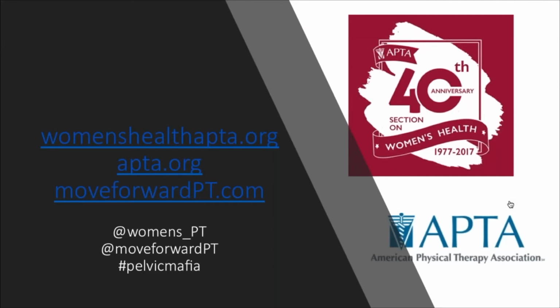So in summary, real-time ultrasound can be used to give additional information to clinicians regarding muscle activity related to the bladder, and can be very beneficial as a form of visual feedback both for the patient and the clinician with respect to pelvic floor muscle training. It should be used in conjunction with clinical picture, including both internal and external pelvic floor muscle examination, and in conjunction with a patient's subjective findings.